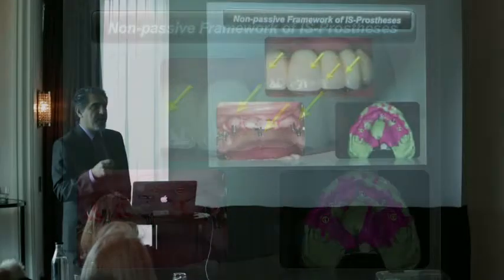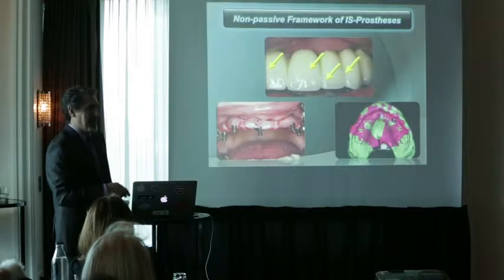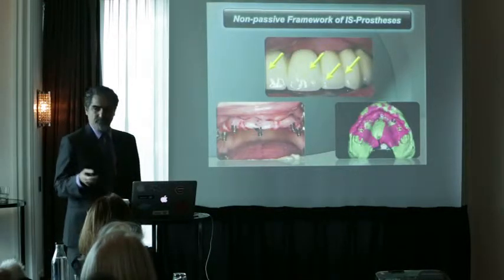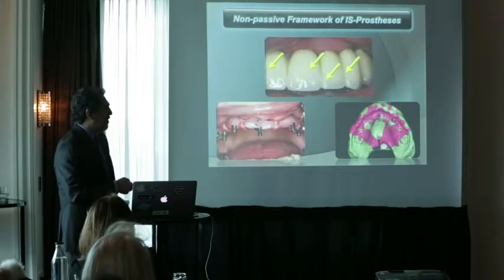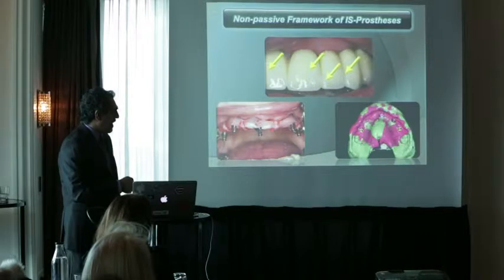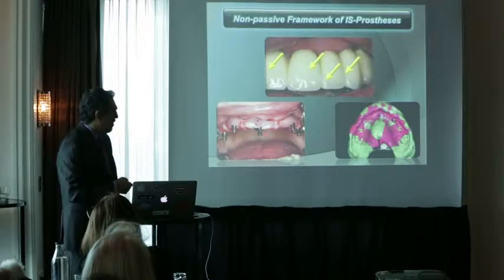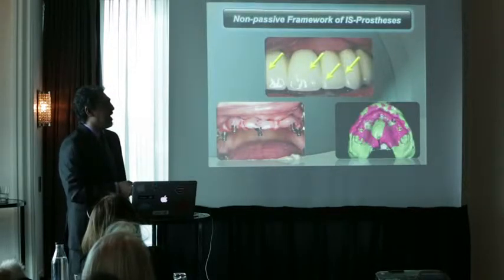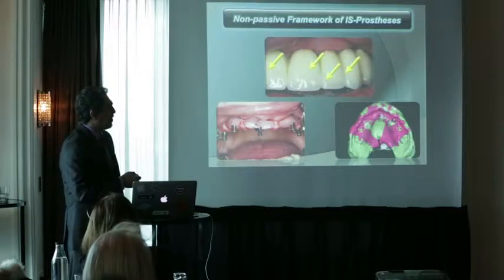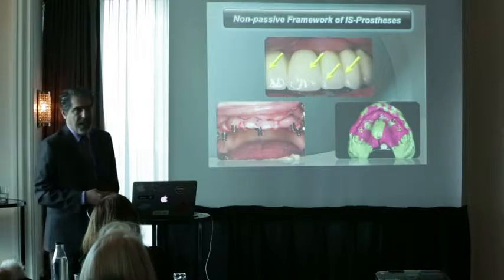All of a sudden I heard the crack, and sure enough, all of the teeth were showing some sort of cracks here and there. The solution? Throw it away. That's it. It's not going to work. You are going to have a new impression, all attached in the patient's mouth with the verification jig. You pick it up, and then you send it to the lab. The lab is going to cut the metal and then develop the right passive framework.